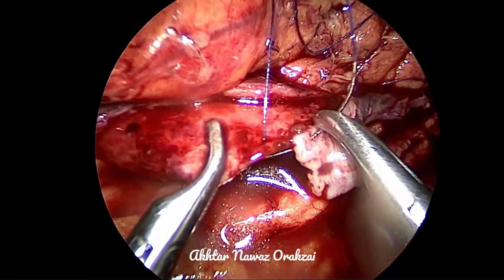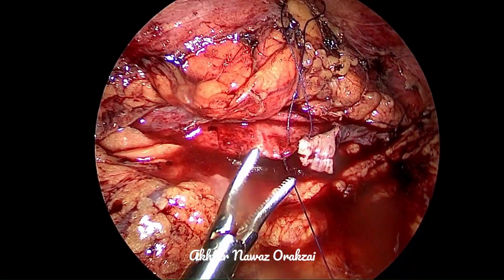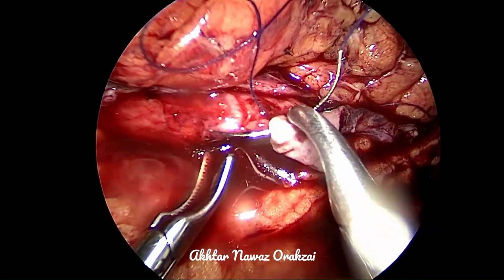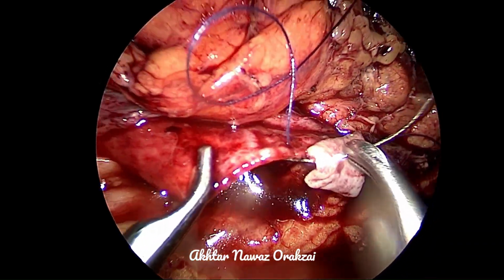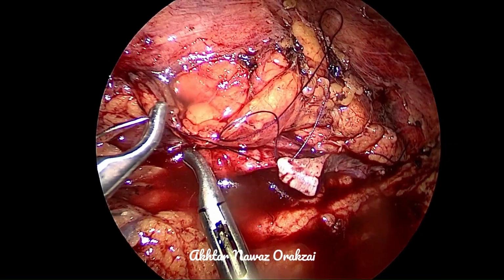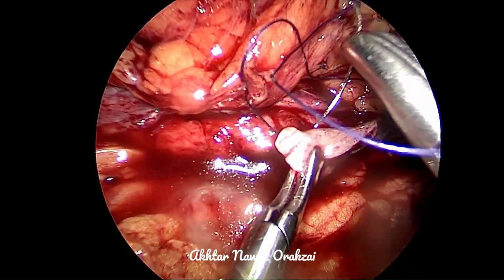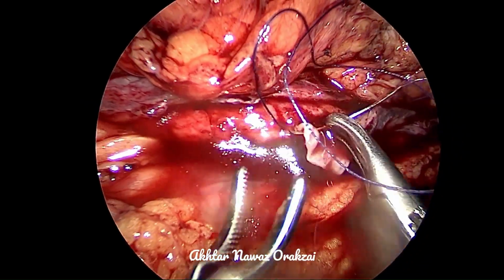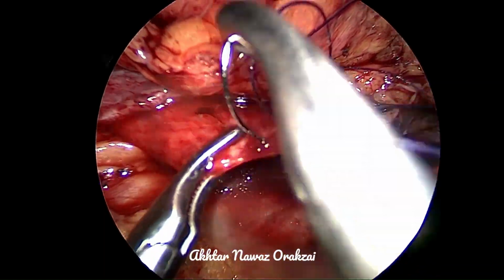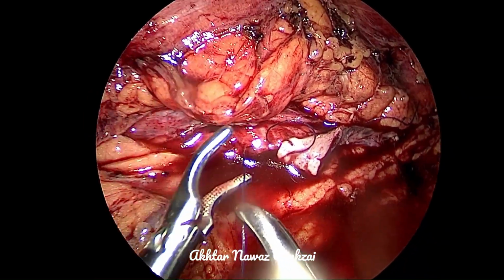Really it's a personal choice whether to go for interrupted suturing or continuous suturing. I personally prefer continuous suturing. However, some prefer the interrupted suturing, more so the pediatric surgeons or pediatric urologists. Results are equally good in both situations. You can do a combination of the two, like 1 or 2 stitches interrupted and the rest of the anastomosis continuous.